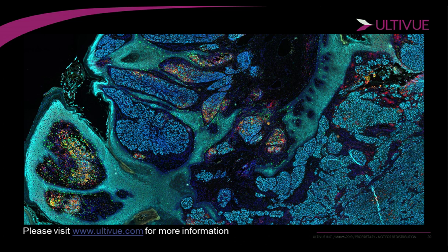any type of relatively run-of-the-mill whole slide scanner that can look at about 5 different colors, so that can visualize a DAPI, a FITC, a TRITC, a Cy5, and a Cy7. Cy7 may be something that is a little bit more specific to a handful of whole slide scanners that are out there, but that's really it. You don't need anything that has any sort of spectral unmixing capabilities or anything like that.